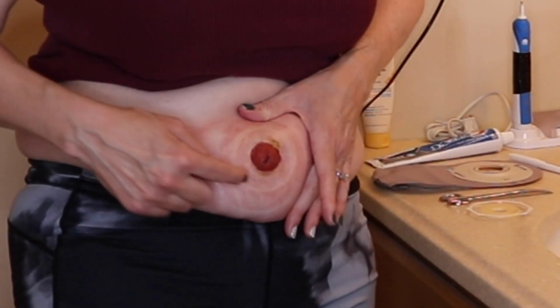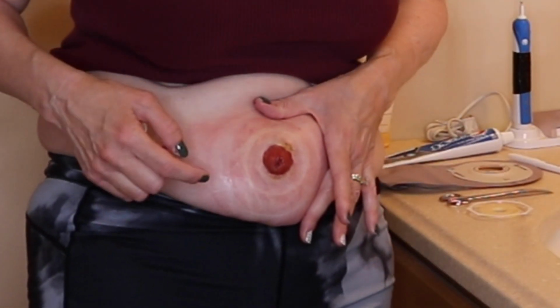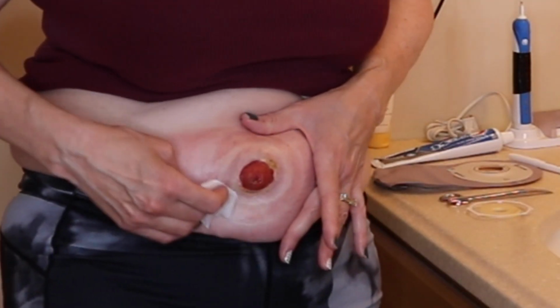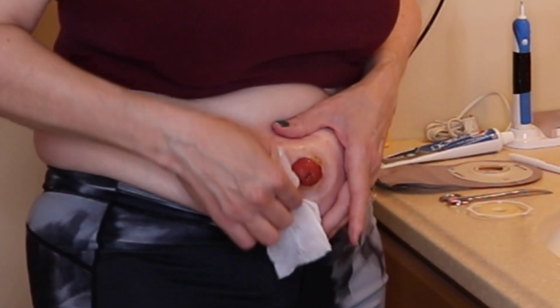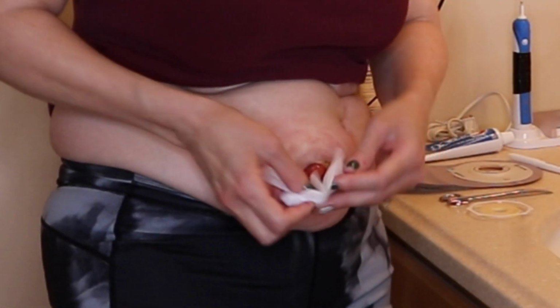Okay, now you can see on here, I don't know if you can see it or not, it's not as dark as it used to be. I'll try to zoom in the camera, but you can see here where there's still some feces. There's some barrier ring residue. So you want to make sure that you get everything all nice and cleaned up. I forgot to put a towel on the floor.